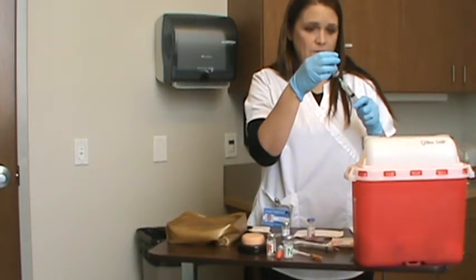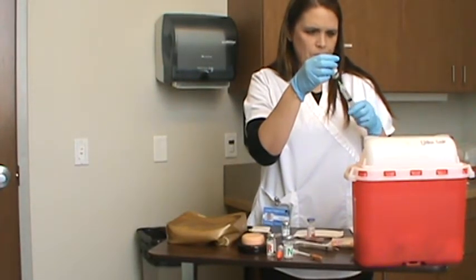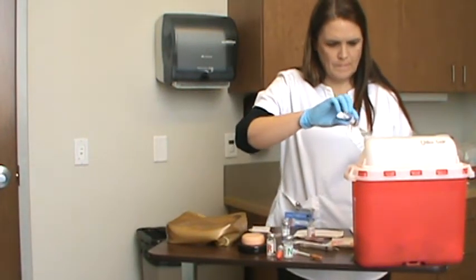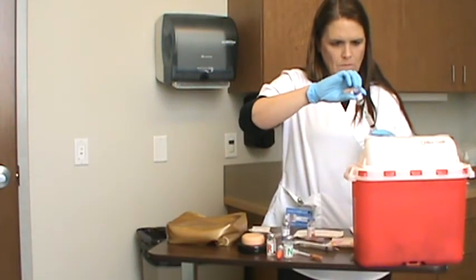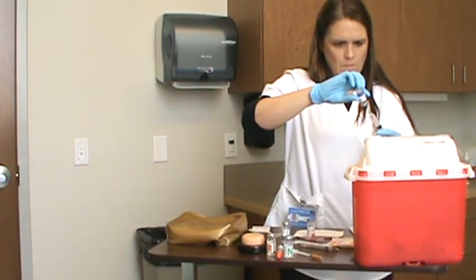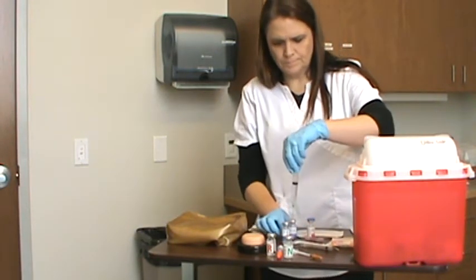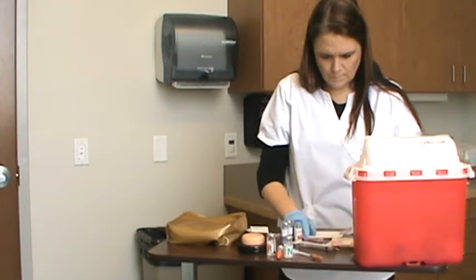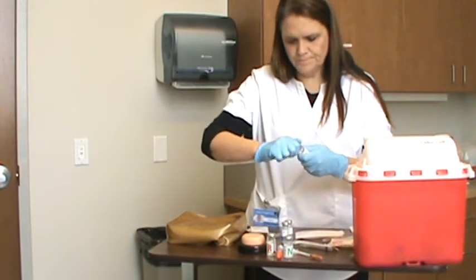It was having issues. I'm gonna put this in.